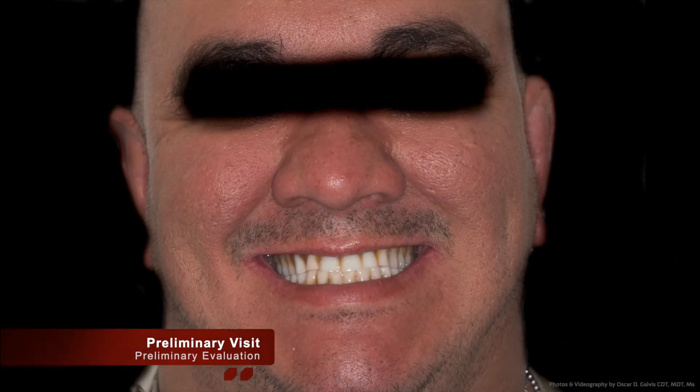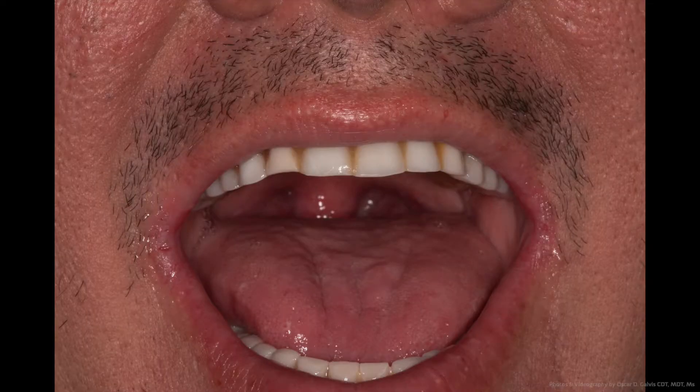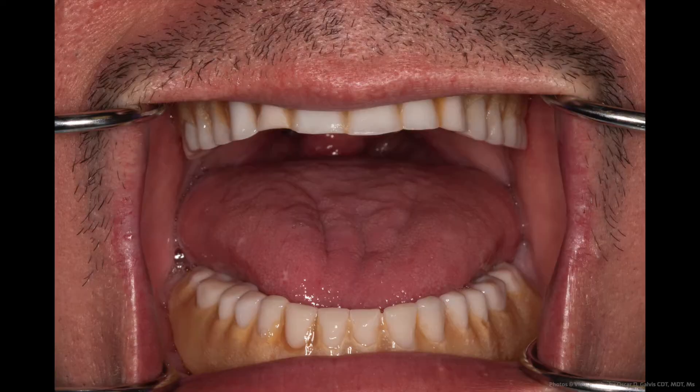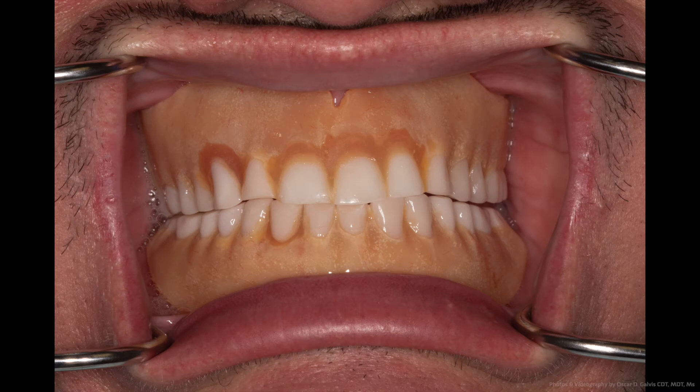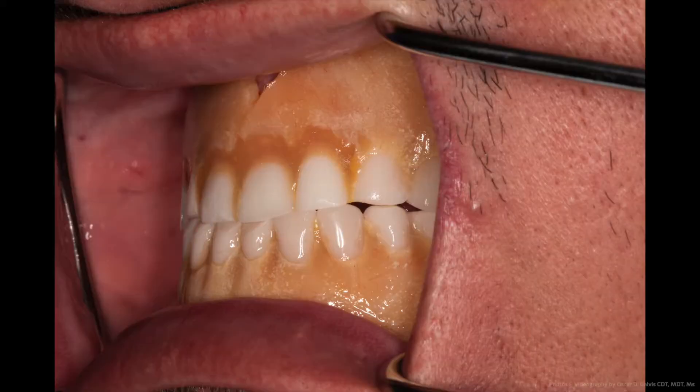The preliminary visit and the preliminary evaluation. During this visit, evaluation photos are taken. The patient presents himself in his mid-30s and unfortunately has lost his teeth at the young age of 26. The teeth you see pictured here are dentures that were made for him over 10 years ago. With 10 years of wear, they have worn down and completely discolored. You can even see the discoloration in additional acrylic where repairs have been made to this complete denture set.